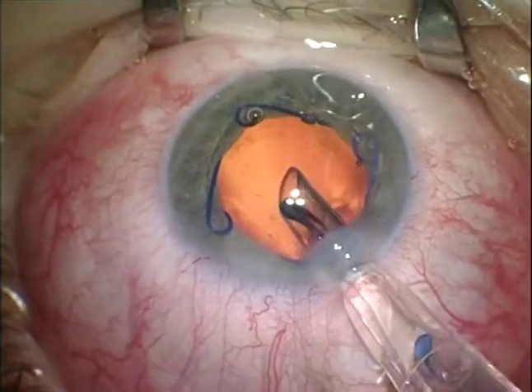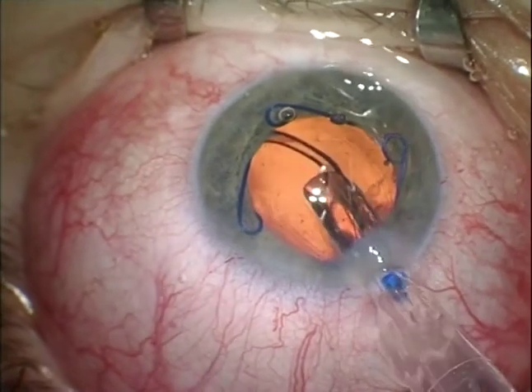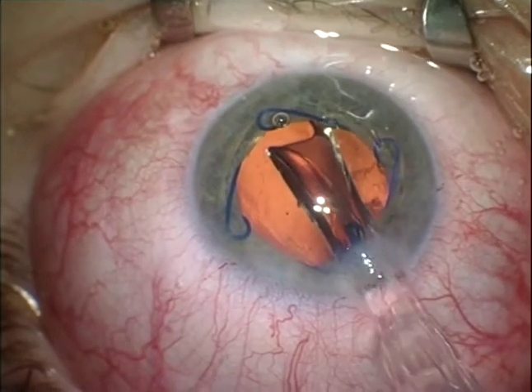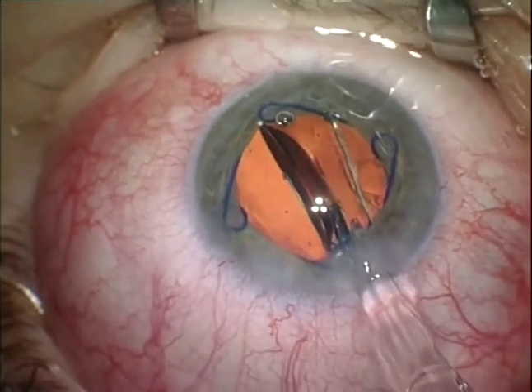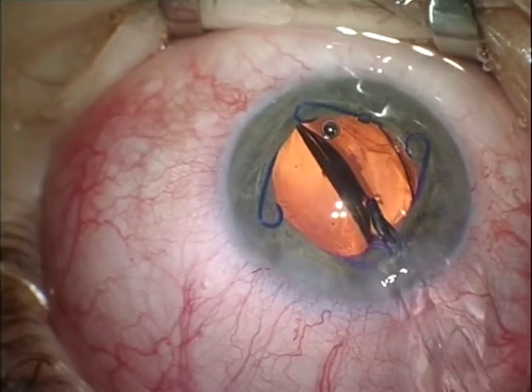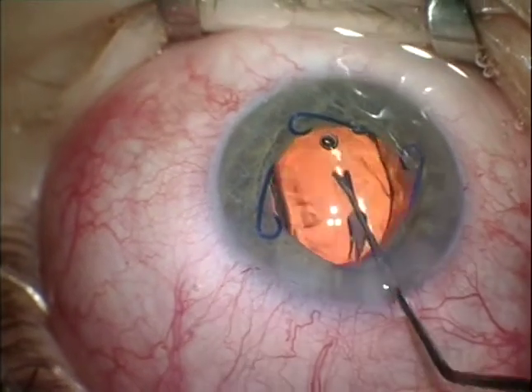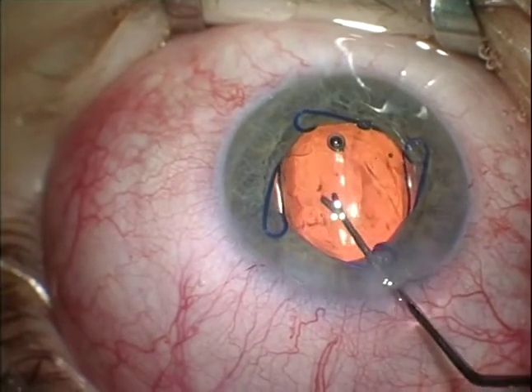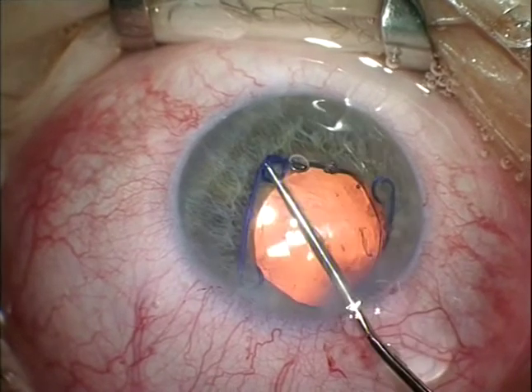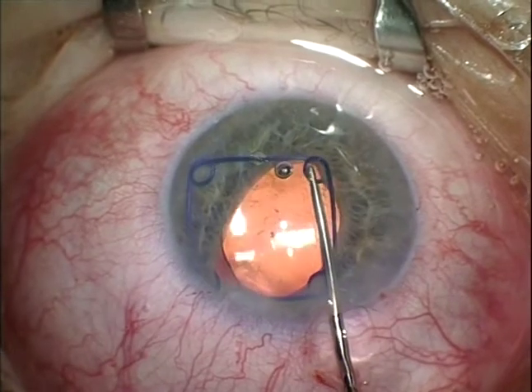capsular bag, and then the IOL is implanted inside the lens capsule slowly. With the help of the injector, I'm positioning the IOL inside the anterior chamber and manipulating the trailing haptic, placing the device into the correct position. In order to disengage the ring from the iris, the manipulator is utilized.